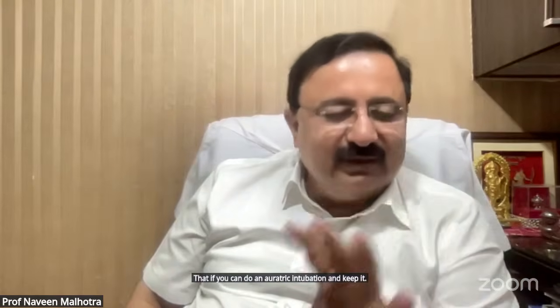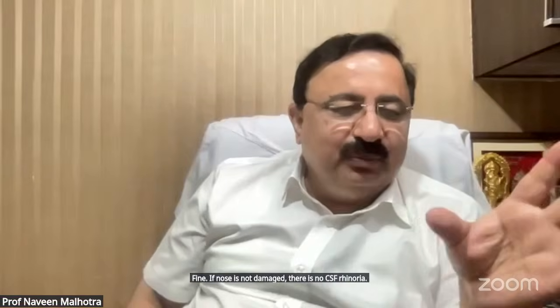The bottom line you have to remember is that if you can do an orotracheal intubation and keep it in the oral route, fine. If the nose is not damaged, there is no CSF rhinorrhea, no epistaxis, no nasal bone fracture, and they don't have to repair the orbital fractures, do a nasotracheal intubation.